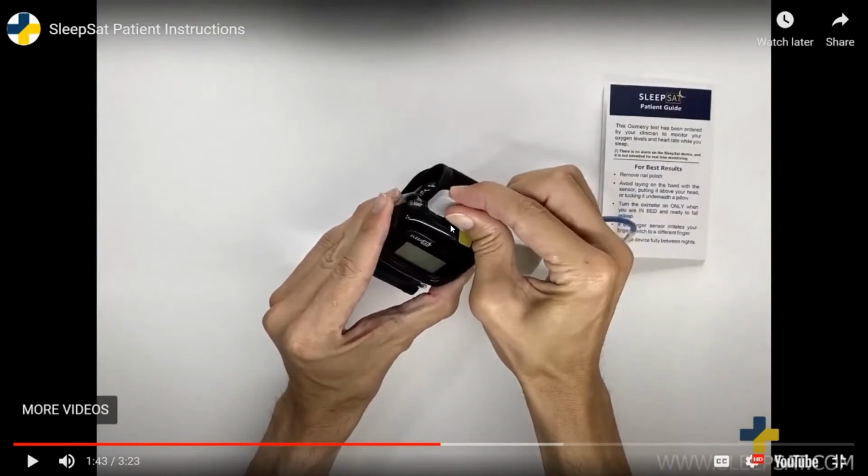All right, this is a really great time to point out, it's not the clearest in this video, and probably through Zoom compression you're seeing it even less, but I would encourage you looking at this video and noticing that at the top of the probe plug, there is a small notch or bump that fits into a notch at the top of the SleepSat female connector. We have been getting a couple of questions lately of if it can be plugged in the other way. It unfortunately cannot be. It always has to be plugged in so that notch and that bump match up.